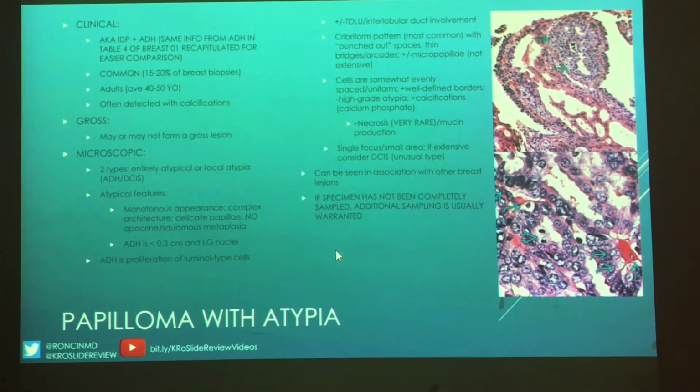So the differences that we have with papillary lesions are whether it's entirely atypical or we have focal atypia. You could mention that in your line, but if you had a biopsy with intraductal papilloma and you're seeing atypia, make sure you mention the atypia, because remember that's a trigger for them to go in and excise. And for papillomas, WHO states that they are atypia that's less than 0.3 centimeters with low-grade nuclei. That's a little different from regular breast, right? But your thresholds should be pretty much identical.